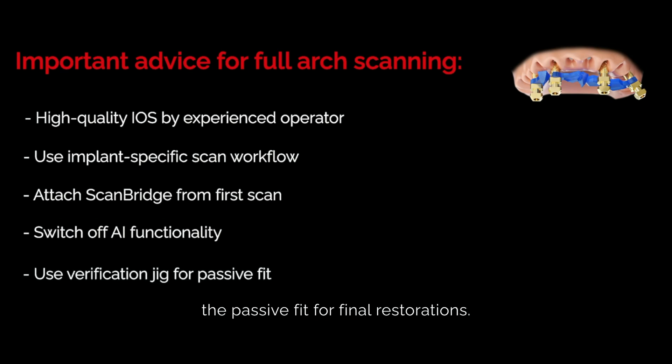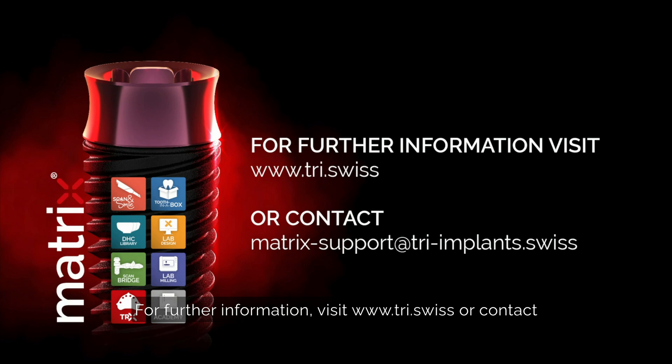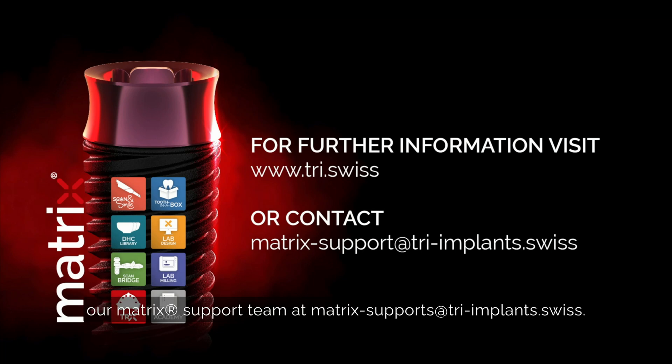Use a verification jig to check the passive fit for final restorations. For further information, visit tri.swiss or contact our Matrix support team at matrixsupport@triimplants.swiss.